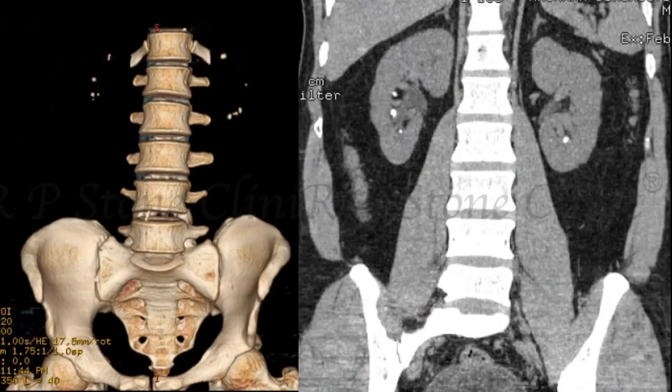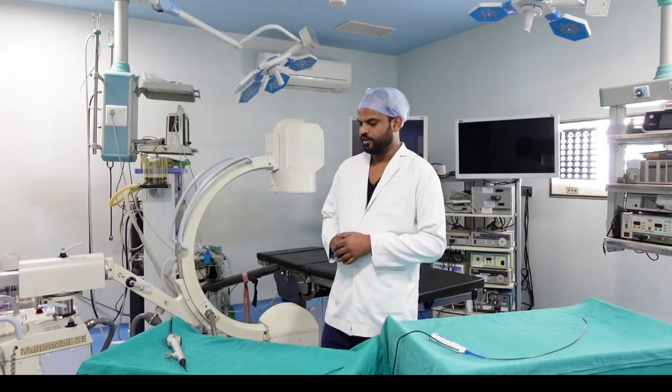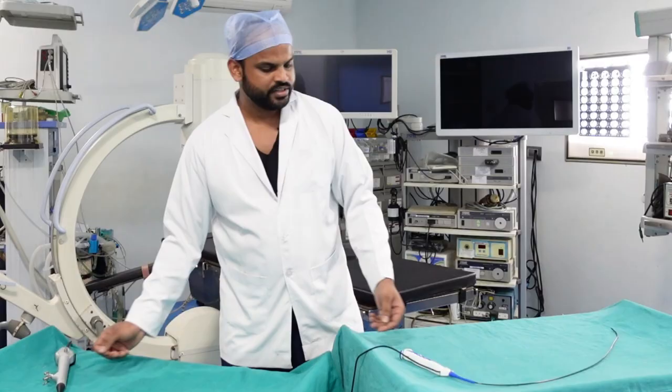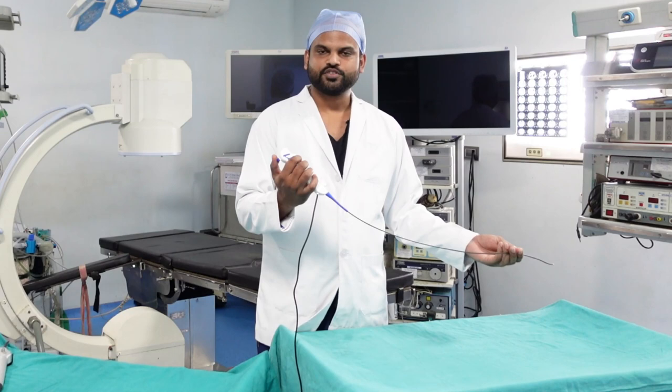Our patient is having bilateral renal calculi. On the right side, we will be using this reusable flexible ureteroscope, Carl Stoess Flex XC. And in the same patient, we will be using Carl Stoess Flex XC1, which is a disposable flexible ureteroscope, on the left side.